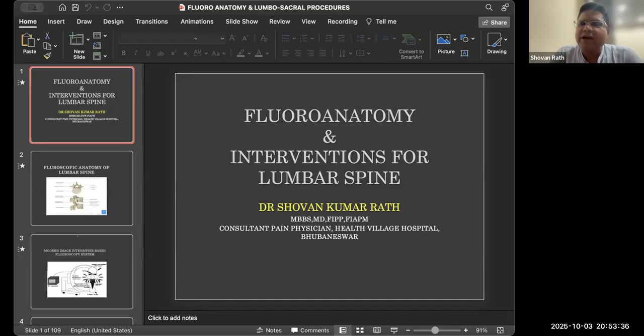Many people are using intradiscal steroids, intradiscal antibiotics, intradiscal PRP, BMAC. Many people are using them. I don't know, but I'm not in favor of that. Rather, I'll be going for a ramus communicans block along with the transforaminal. That is a safer one. You don't have any complications. And in the initial days, I'll be advising those who are starting their practice that they should not touch the disc at all, because discitis is the most horrible complication that anyone can face.